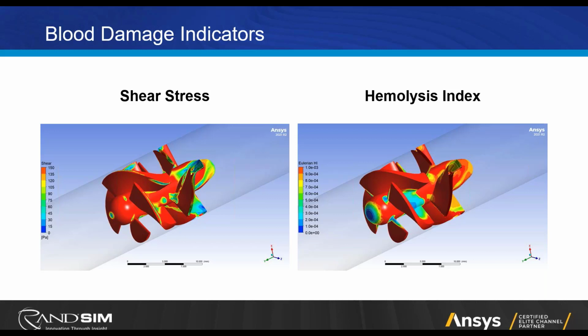So what I've plotted on the left is contours from 0 to 150 for shear stress. And then we ran the hemolysis model too. The first thing I tried to do is create a contour plot that was qualitatively similar to the shear stress plot, because I think people have a pretty good understanding of what shear stress is in general. You can sort of imagine it, but hemolysis index is not very intuitive. So this is an attempt at me to level the playing field and get the hemolysis range tuned in with that of the shear stress, so we can make comparisons between the two.